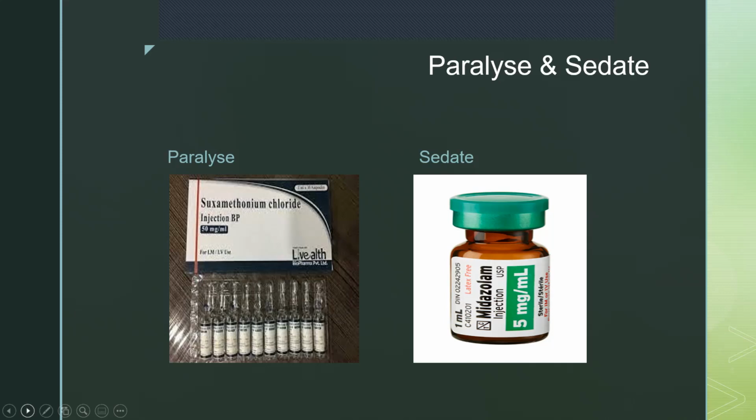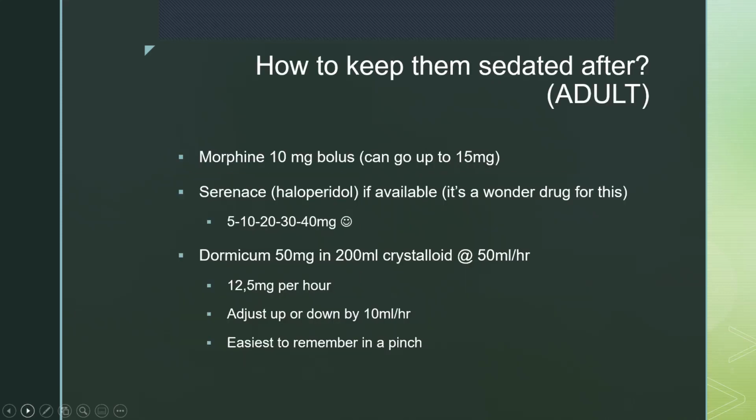It also makes it easier for you to then ventilate the patient, because otherwise you're going to be breathing against the tube if you were the patient. By keeping you nice and calm, we breathe for you. Those are the basic tenets of it. So how do you keep them sedated? It's all well and good that you've gotten the tube in, but the patient's going to start waking up. There are a few ways that you can keep a patient sedated.